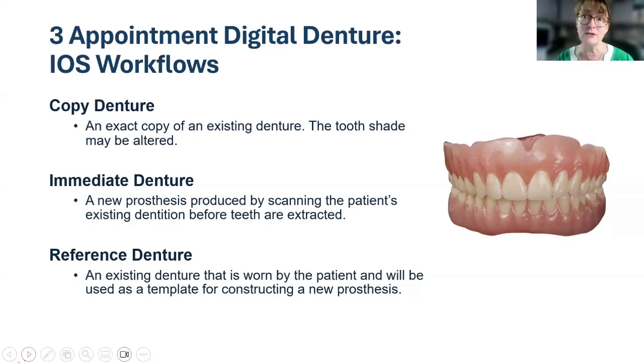You wouldn't even need to scan the intraoral cavity. So that one's very, very easy. The immediate denture is typically very easy because there's some existing dentition that we are going to make an immediate denture from. It'll be a healing denture, and we might do a reference denture technique on it, maybe 3 months later. But immediate dentures are also very easy and successful to scan.